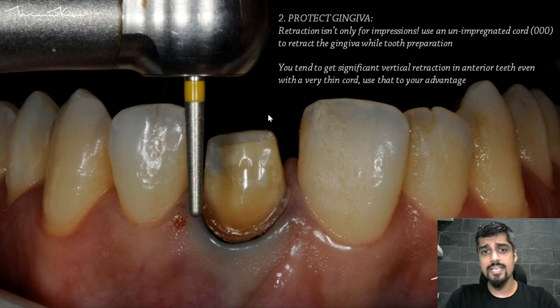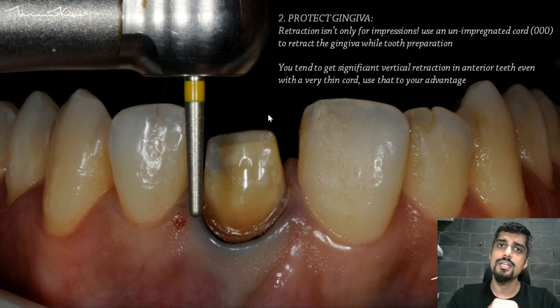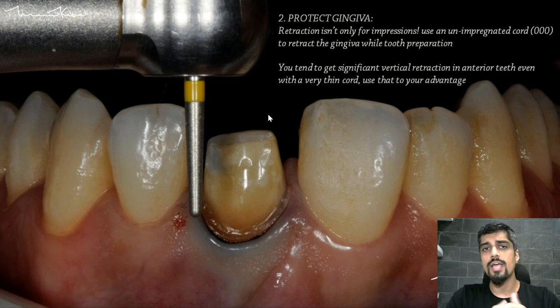In this case we are opting for a sub-gingival margin because the substrate tooth is quite discolored and we are going to be changing the color of the tooth. If the margin of the natural tooth and the ceramic is visible, then you will have an aesthetic failure, especially if the patient has a high smile line. I definitely want to tuck the margin under the gingiva so that it looks natural and we are able to change the color.